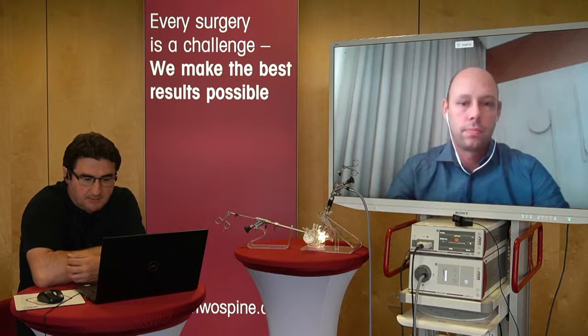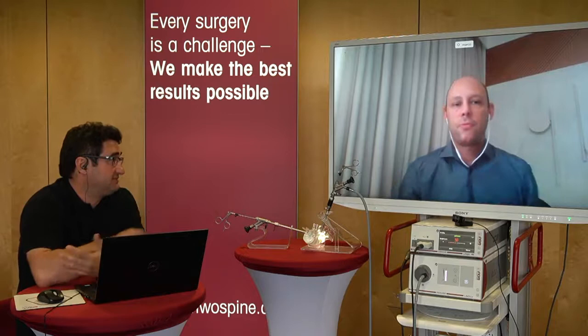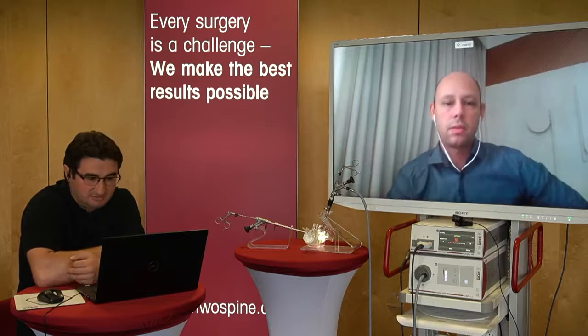Another question, Marco. Which type of sheath do you prefer for lumbar discectomy? The working sleeve? Yes, I prefer the bevel, the triangle, 30 degrees. It's standard for us.